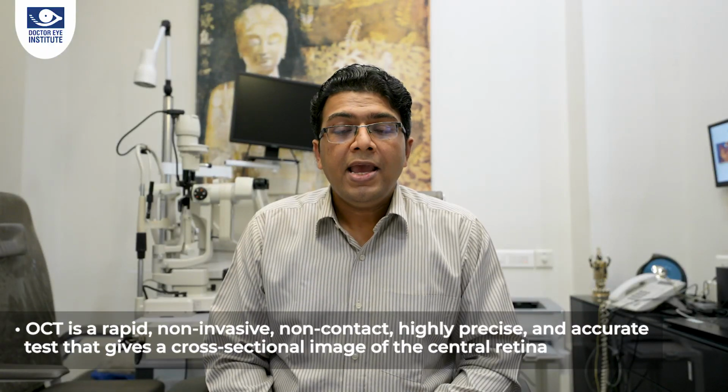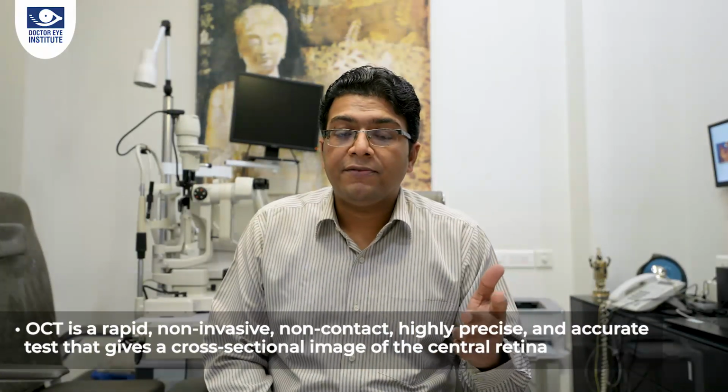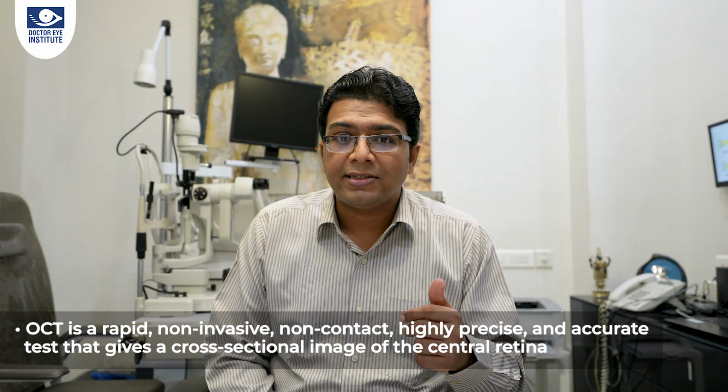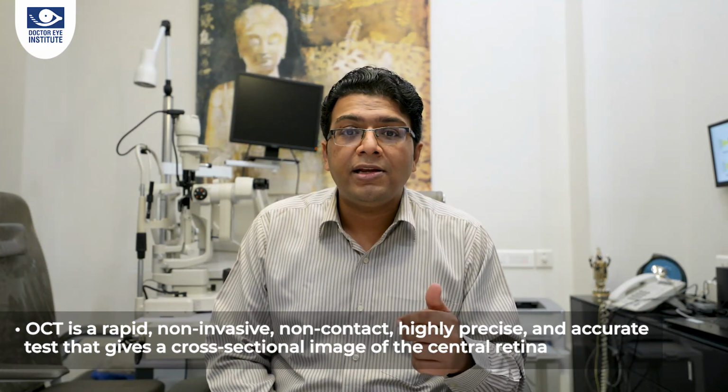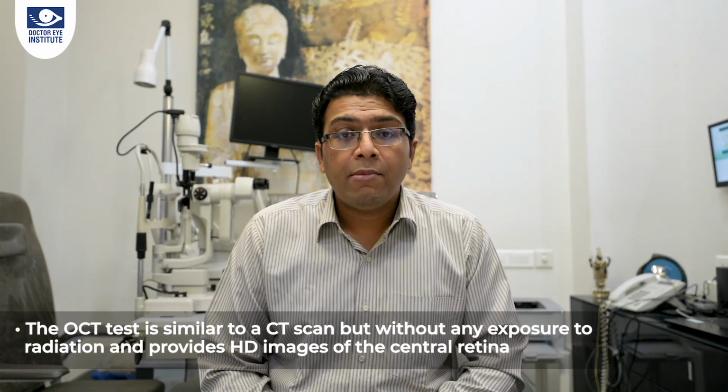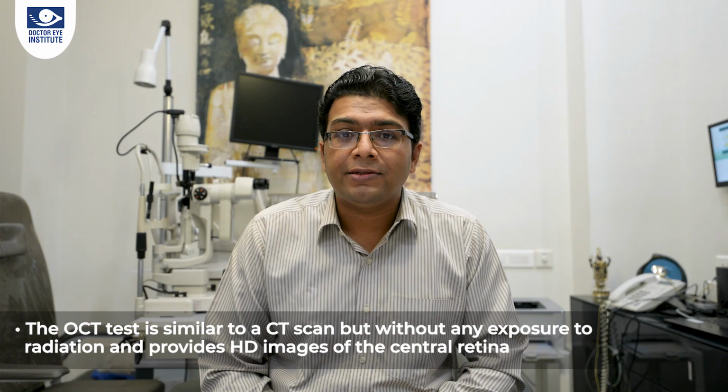The OCT is a rapid, non-invasive, non-contact, highly precise and accurate test that gives us a cross-sectional image of the central retina. It is similar to a CT scan but without any exposure to radiation.